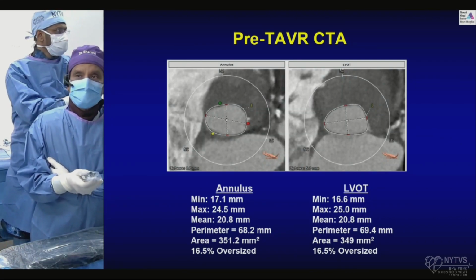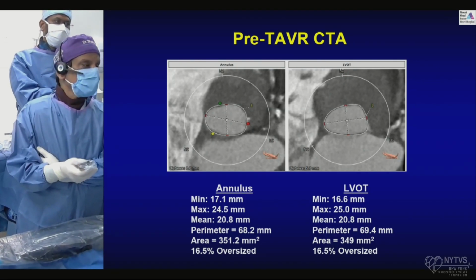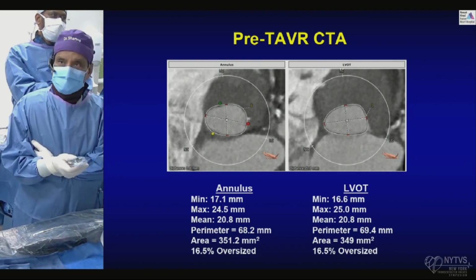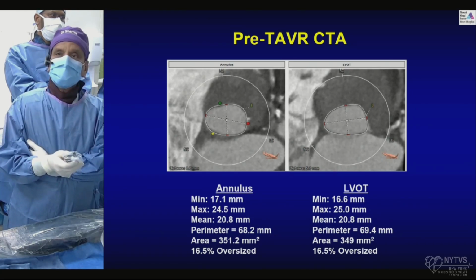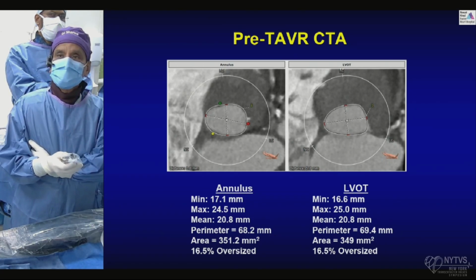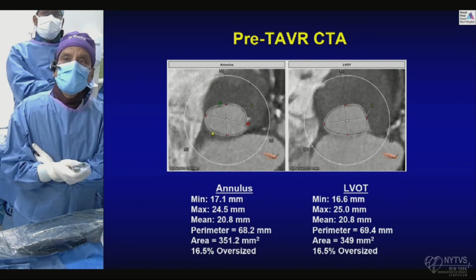You can see the hemodynamic tracing. Luckily the pigtail just dropped into the LV, so we took some hemodynamic tracings, and you can see there's more AI than AS. But definitely HALT and degeneration can present with regurgitation, not just stenosis. So I think it's mixed valve disease at this point.